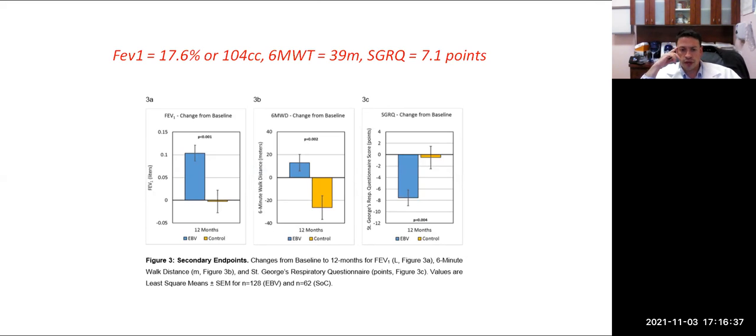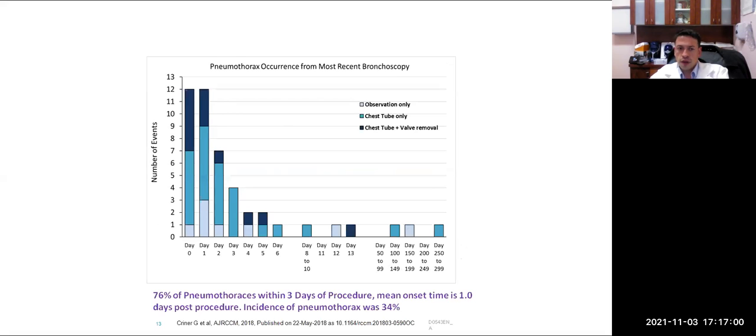So this is close to that. And then the 6-minute walk test, same thing. That is clinically significant. It's a marginal improvement in FEV1, but I can tell you from my own limited experience, these are patients who are very sensitive to even small improvements in FEV1. So if you could give them that 18% improvement, that could be a tremendous quality of life difference as well.